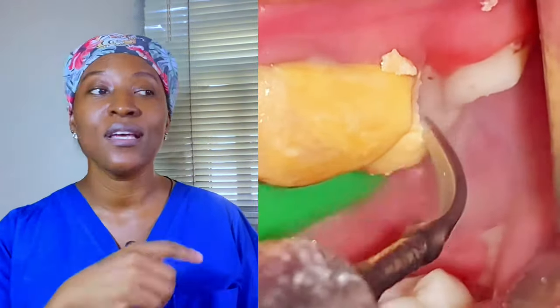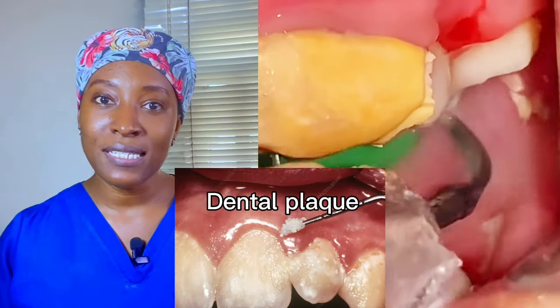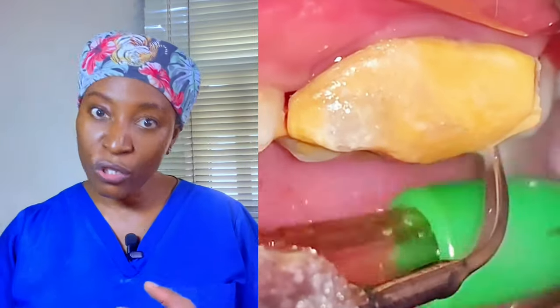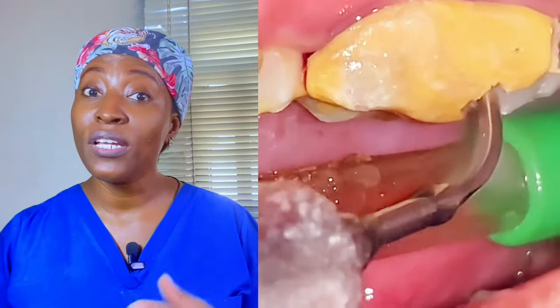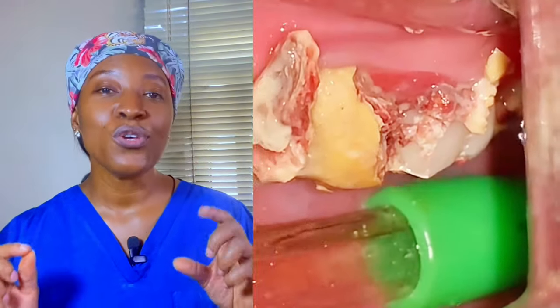Because if they had, all of this would have been seen on time. Calculus is filled with bacteria which causes gum disease. How this forms is: the bacterial plaque that forms on your teeth over time tends to accumulate in certain areas. If you don't brush it off, it hardens, and once it hardens we call it calculus or tartar, which is what I see on this video.